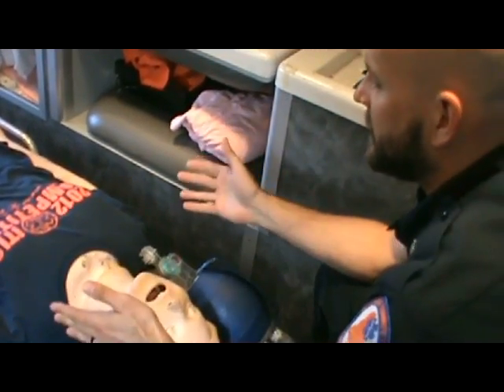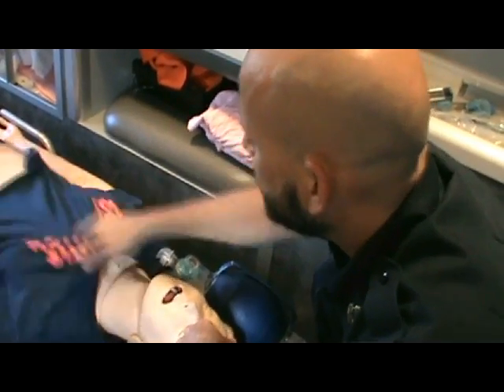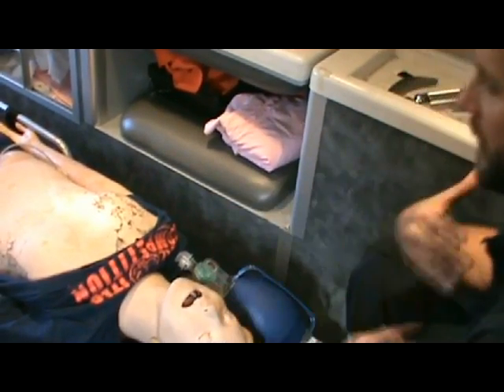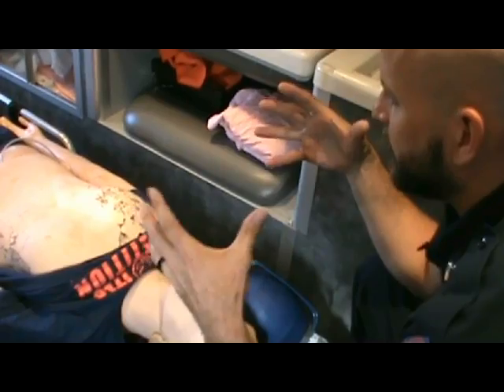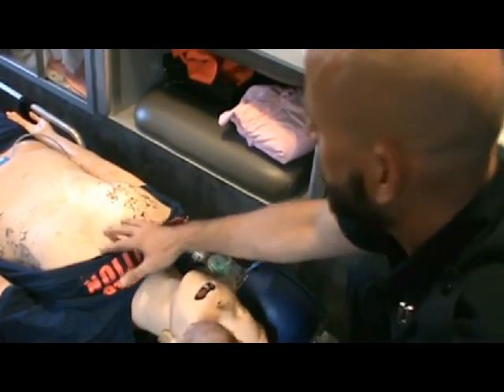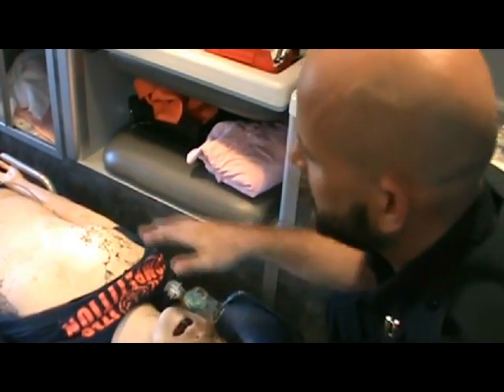Now, about chest rise — we've always taught with kids that to see retractions or adequate chest rise you have to remove the shirt. If they're wearing more than a t-shirt, you need to actually look at the chest. The lungs are almost fully inflated before the chest wall is even visibly seen moving, because they have very limited potential space. Once the lungs are fully inflated, then the chest wall expands. As soon as you see the chest move, that's enough — don't puff it out like Superman.